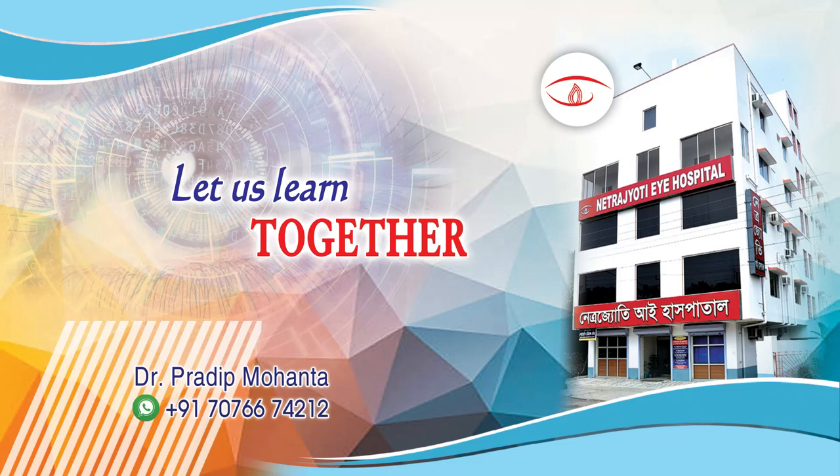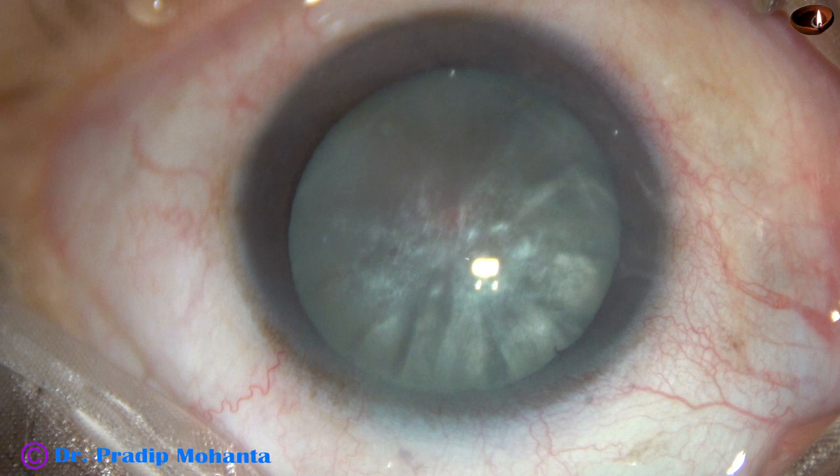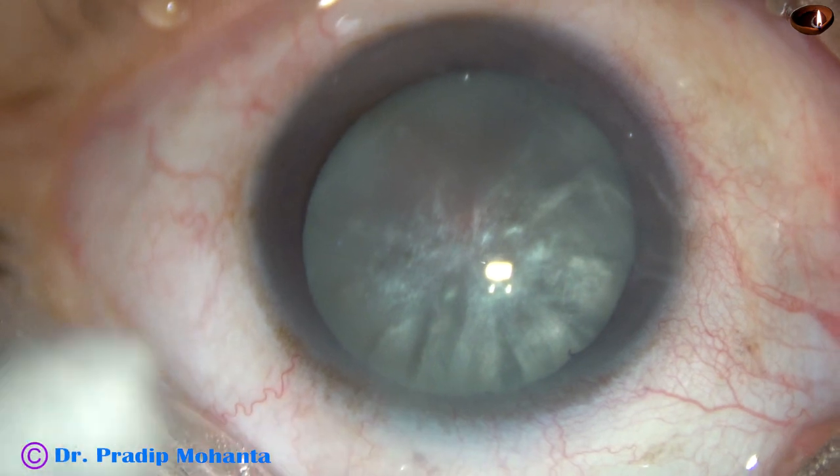Friends, welcome to my workplace at Ranaghahat, West Bengal, India. This is an intumescent cataract with a very hard nucleus. Let us observe this surgery.